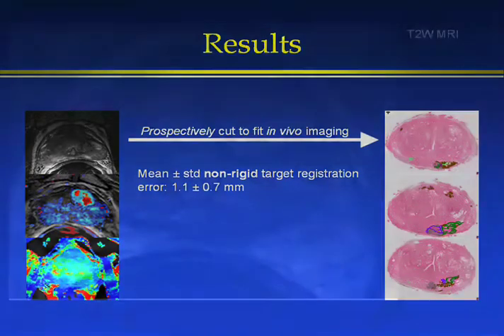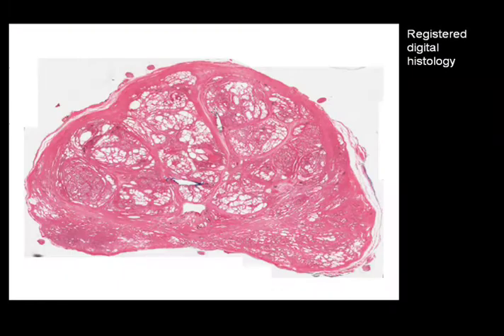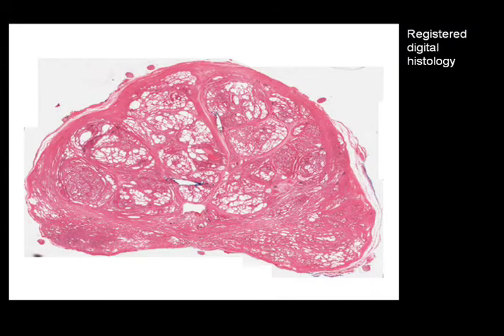What that looks like on imaging, you can see by comparing the MRI with the co-registered histology slice. If I can direct your attention to anatomical features, this is BPH, and you can see tracks running between BPH regions. And if we look at the MRI, you can see these same tracks and the same BPH consistent between these. So you can see this registration has high fidelity.